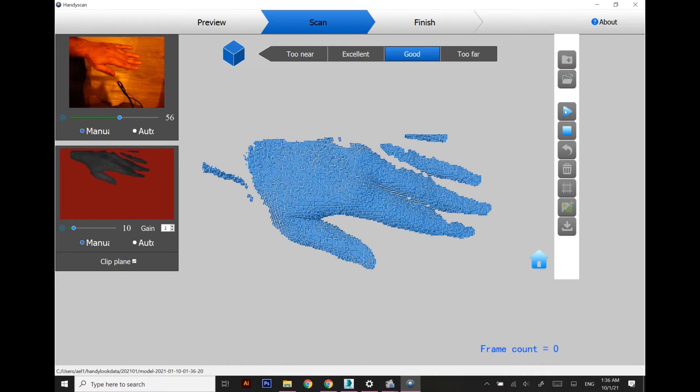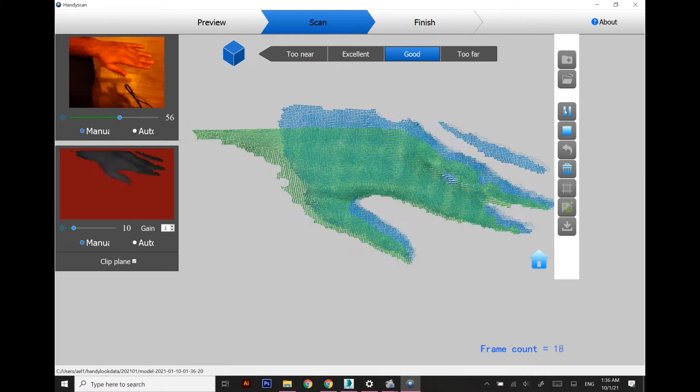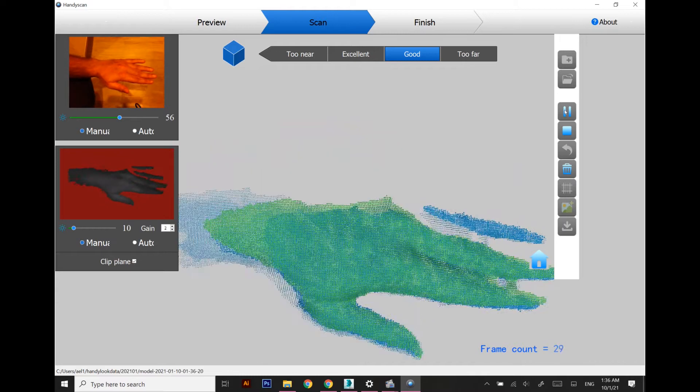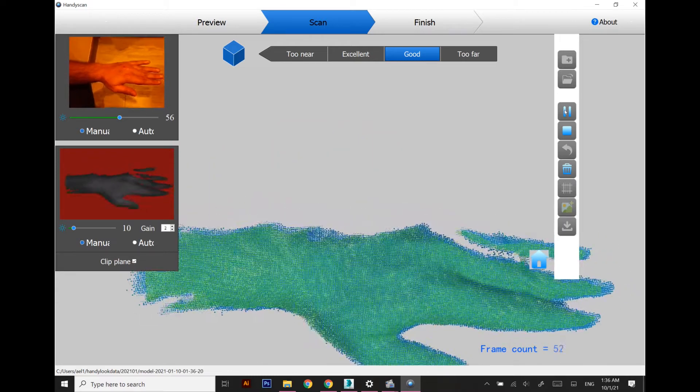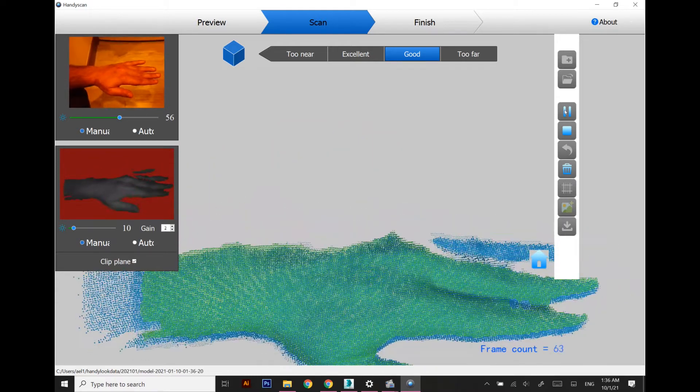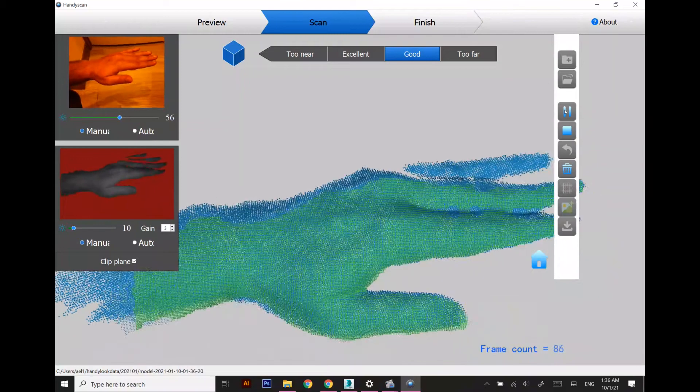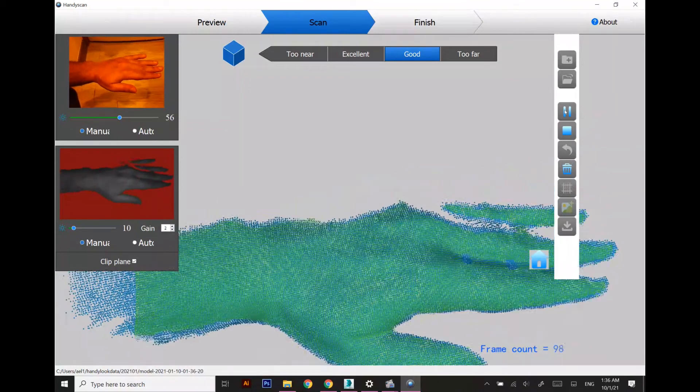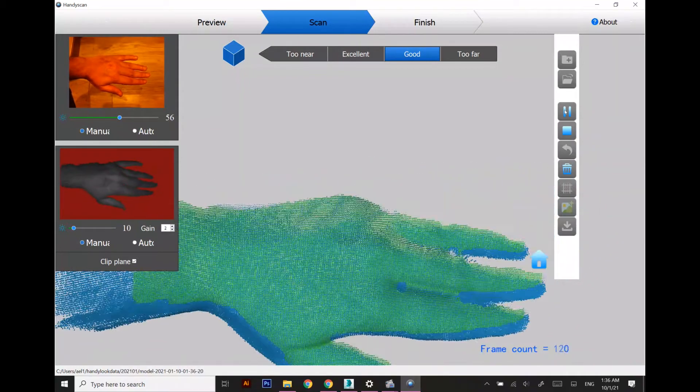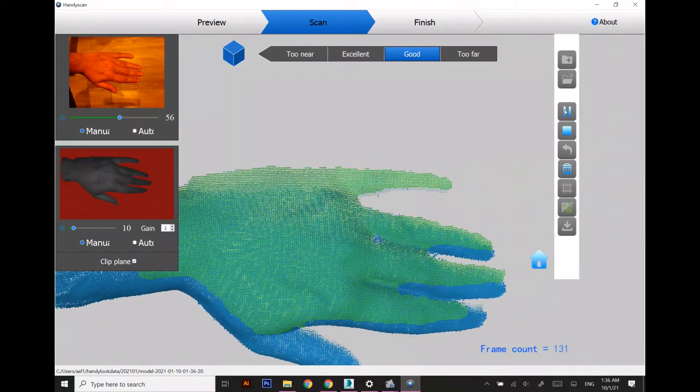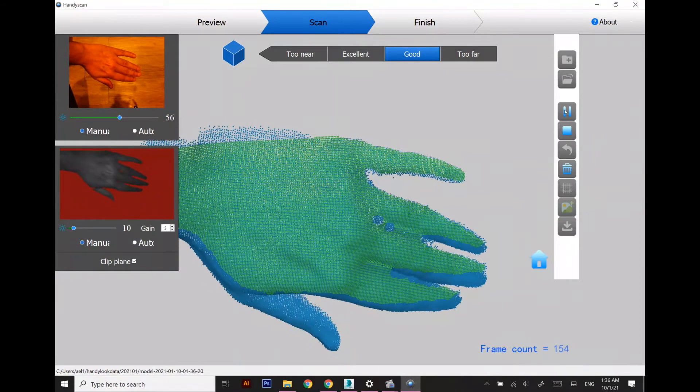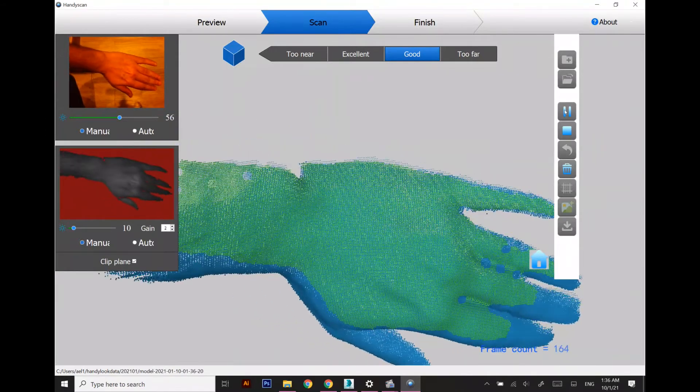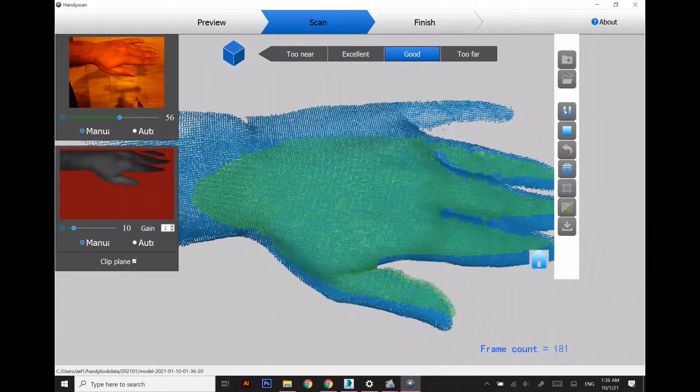Hi viewers, today we are going to model a pair of 3D printed splints for our hand. For that reason I need to scan my whole hand. Splints are basically braces or prosthetics which are 3D printed.